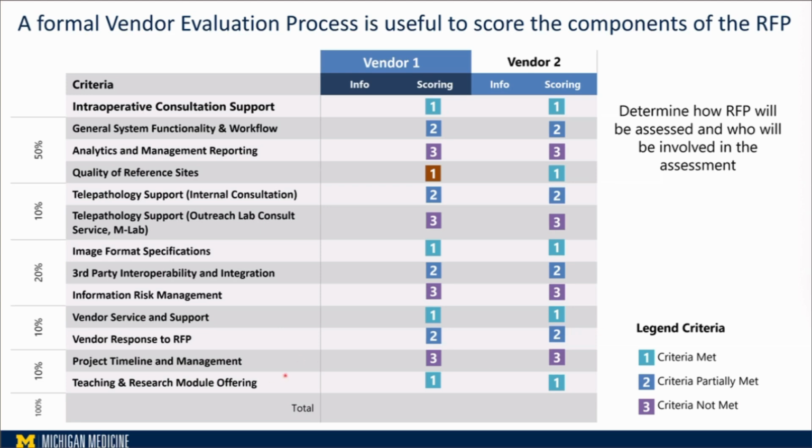Things that you really, really need to write into the contract. For example, the things that we put into the contract from our end, we said we cannot work with any vendor that is not going to provide a standard format, for example, DICOM format in pathology. Even if you don't have DICOM format at this moment, maybe we can work together with you, and give us a timeline for when this format is going to be available in your system.